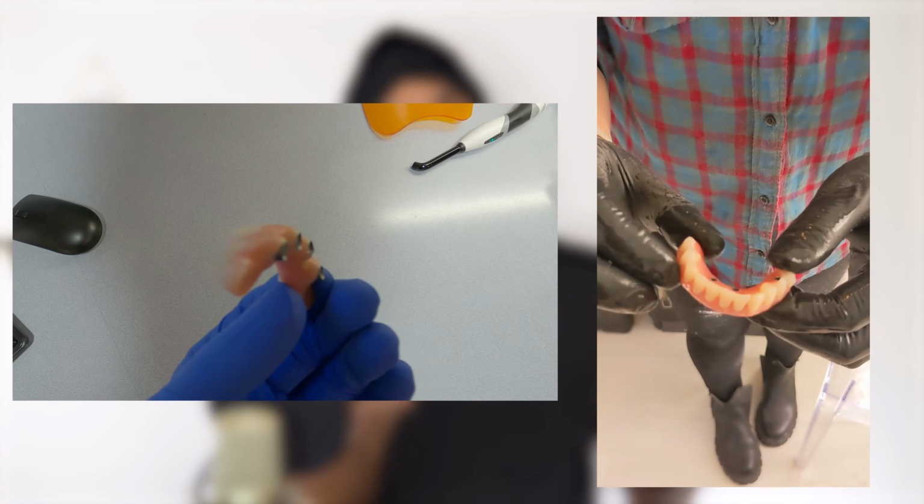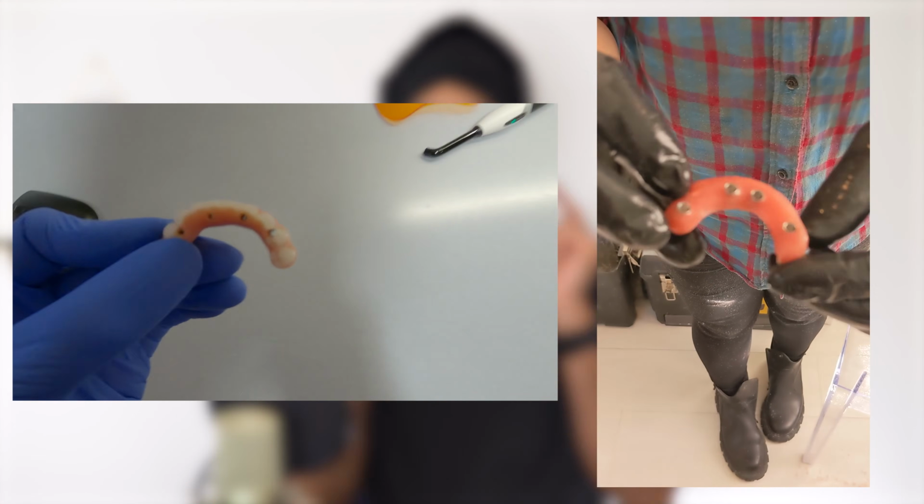So let's look at our three solutions, but this time from a size of appliance point of view, because bulkiness is important. I know this from having conversations with my patients. When they have an all-on-4 treatment, the temporaries are pretty bulky, but when they have the final bridges, the final ones are a lot thinner, and this makes a difference. So our initial prosthetic, the removable denture, is the bulkiest. We need that surface area, which we've discussed. We need to cover the roof of the mouth, typically, especially if we're not using a chrome denture.